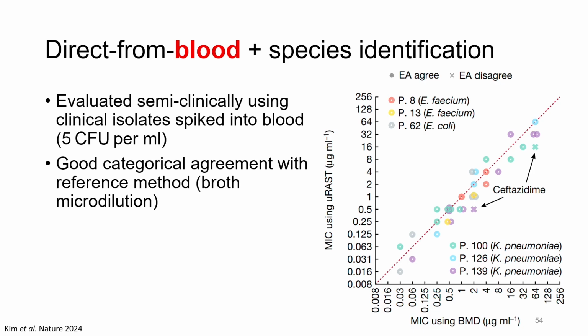You can see there's some disagreement, particularly with Klebsiella and ceftazidime here. So clearly, room for more validation of this technique, but it's very exciting and potentially could have a huge clinical impact if it's pursued further.